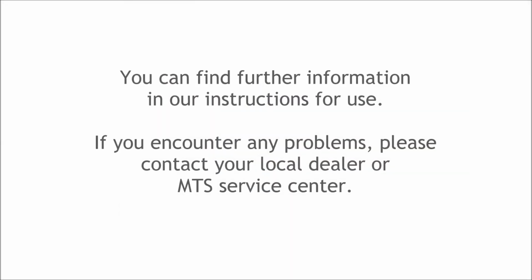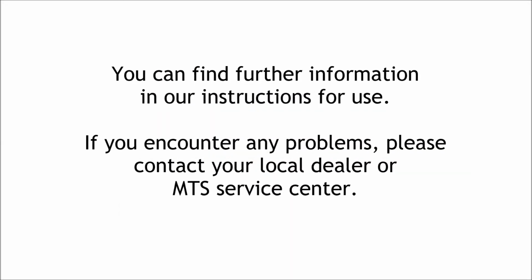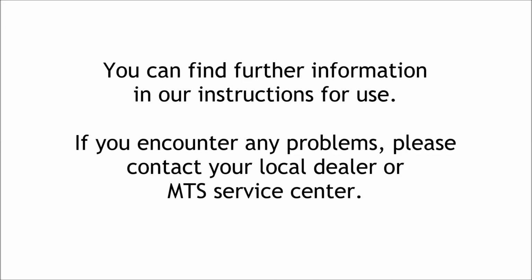You can find further information in our instructions for use. If you encounter any problems, please contact your local dealer or MTS Service Center.